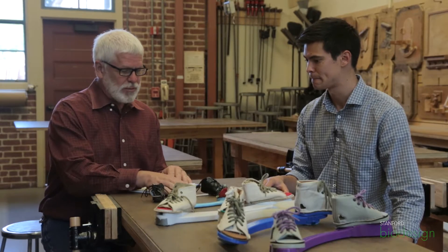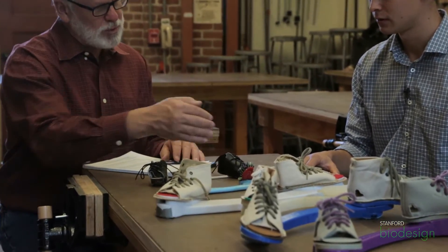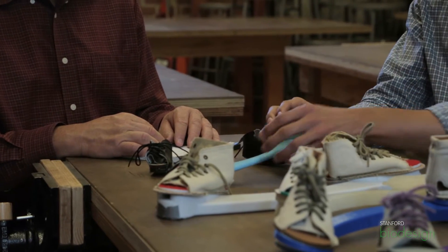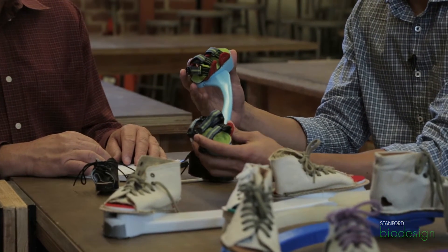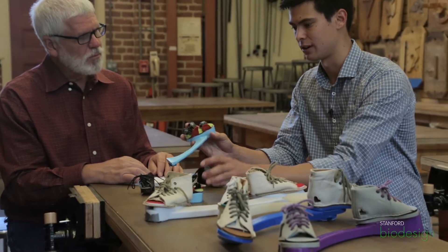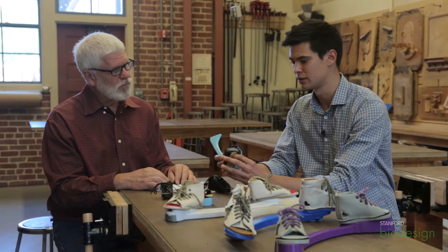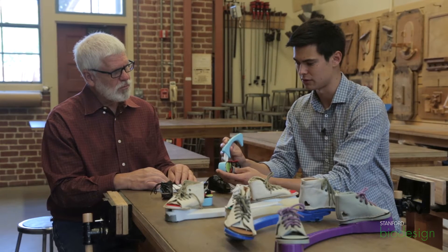So this is quite a leap from this wooden one to now a plastic one. What's the difference between these two? So this one is a 3D printed prototype, and basically the question we were trying to answer with this prototype was, what would a clubfoot brace that had detachable shoes on it look like? We wanted to make a brace with detachable shoes to improve ease of use, and this was our first stab at that.